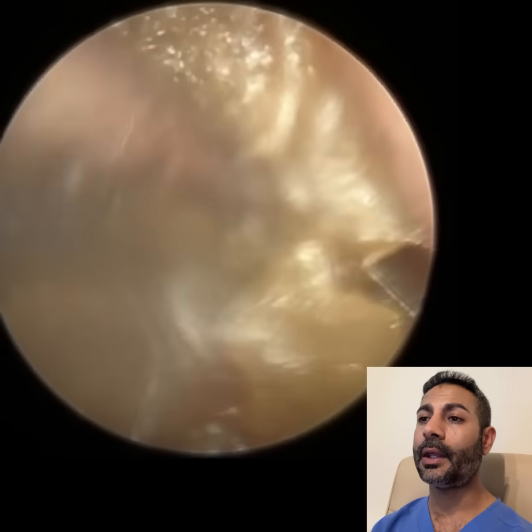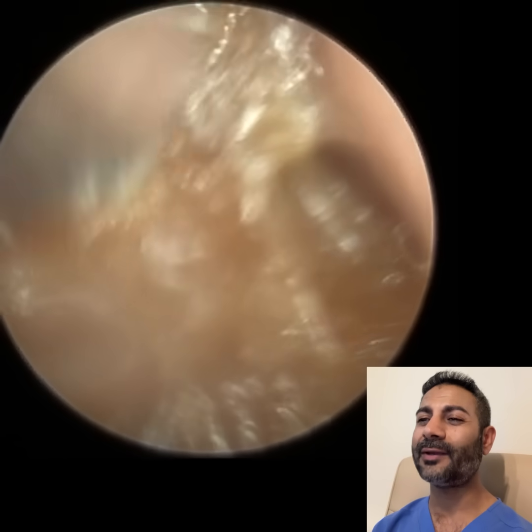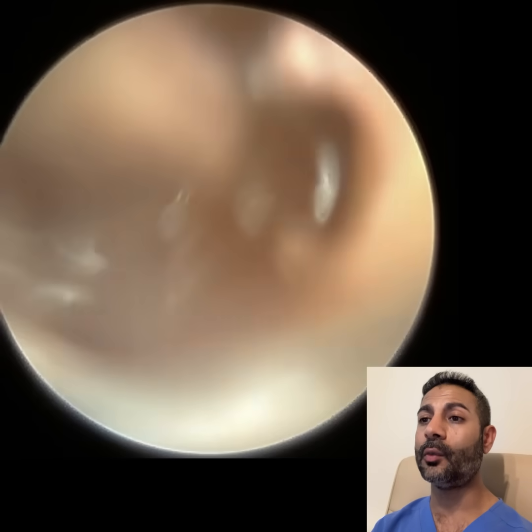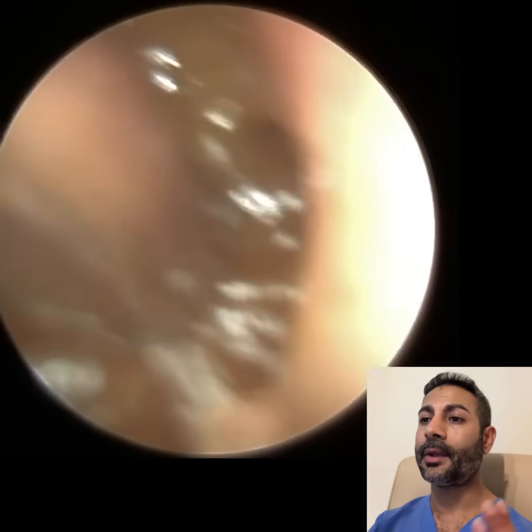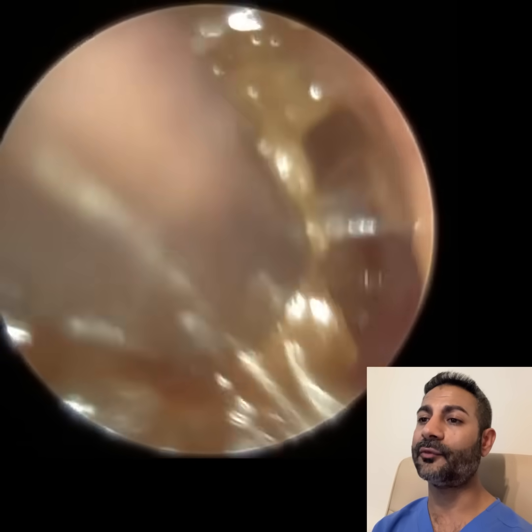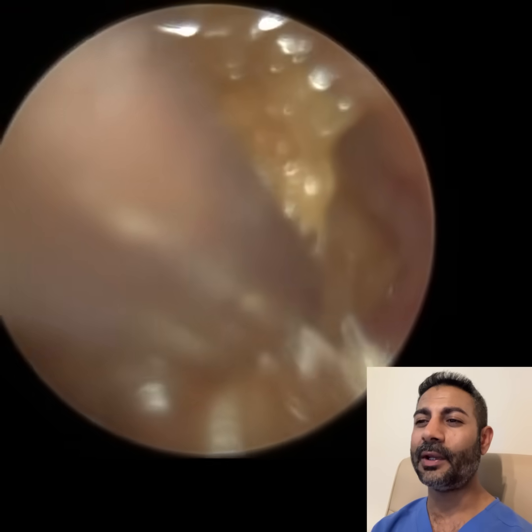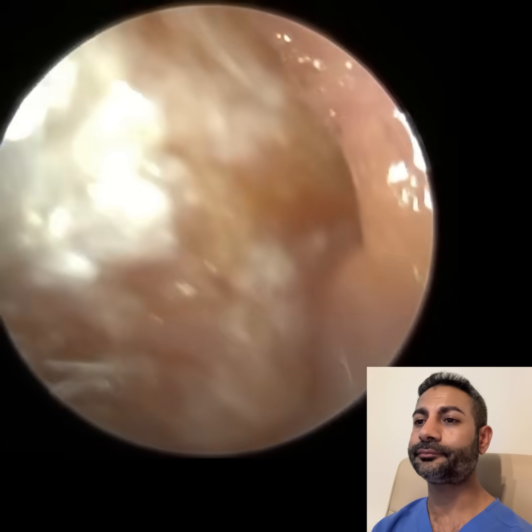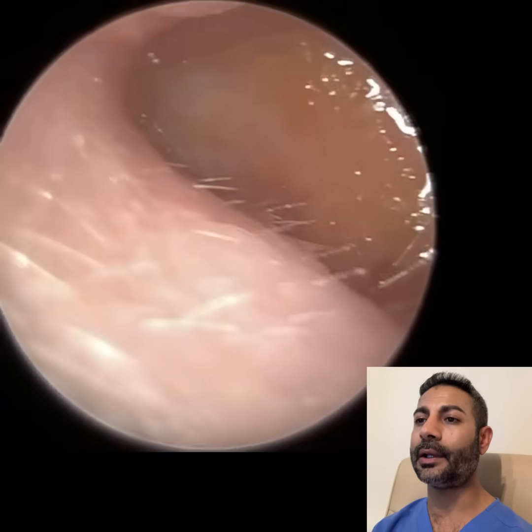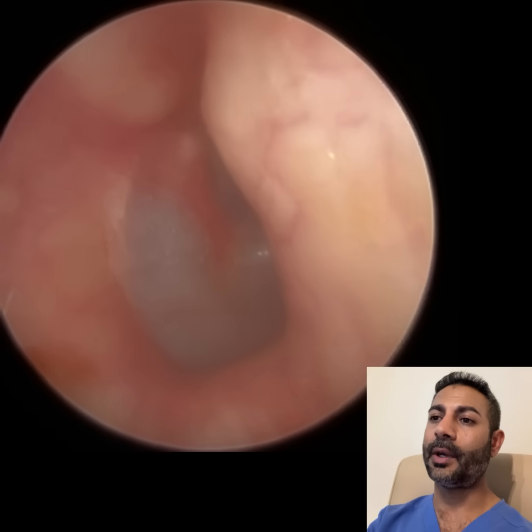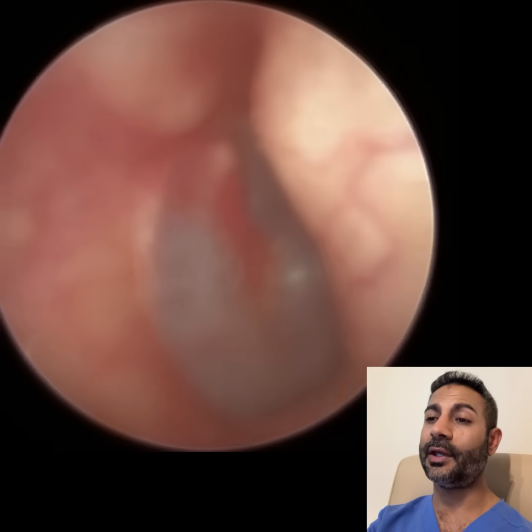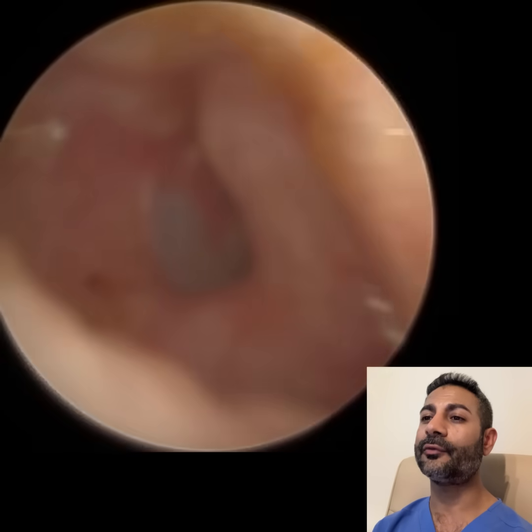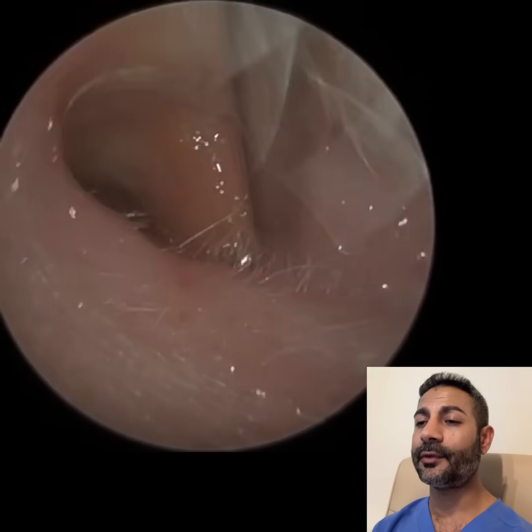This ear — this is actually the worst ear; I'll show you the left one first. The wax is a bit mushier, softer. I've just put some olive oil in, just like I did with the left side, and the oil works a treat here. It's a bit blurry because of the oil, but the oil binds and coagulates the wax plug together and it comes out in a singular piece. Normally there's always some residue in the anterior recess — a little widening near the eardrum on the right-hand side. You can see there's a bony protrusion on the right, one at the top near the eardrum, and also one a bit further out in the midsection of the ear canal. I've got a still shot for you guys so you'll see the wax on screen.